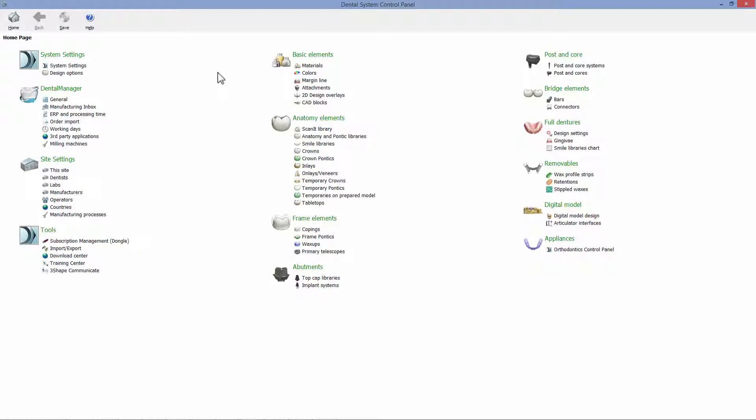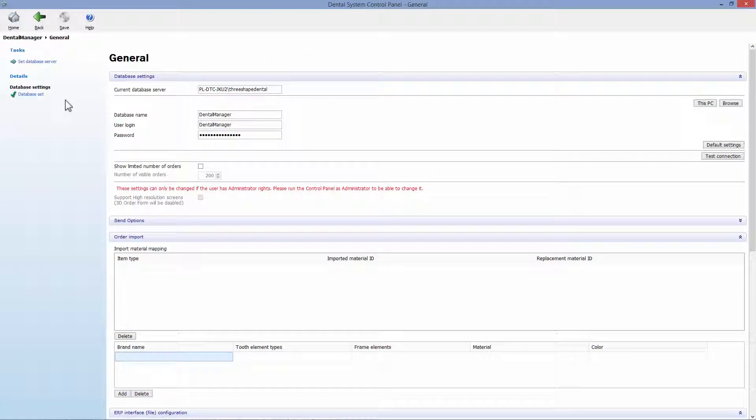We improve the performance by automatically deleting orders older than a specific date. To activate, open the general option of the dental manager in the control panel.